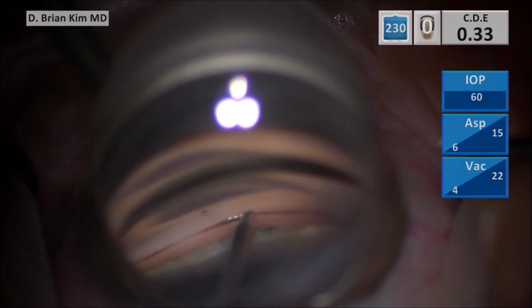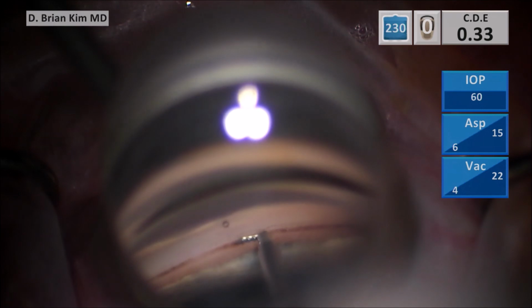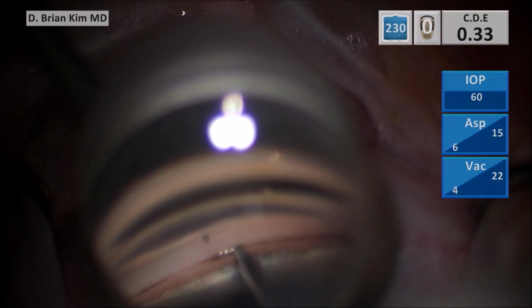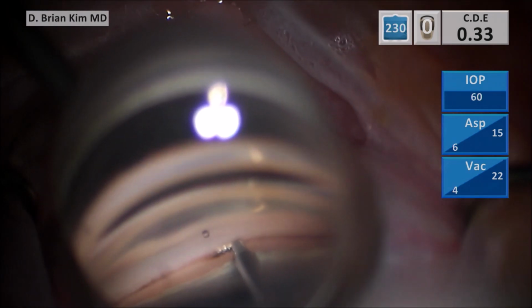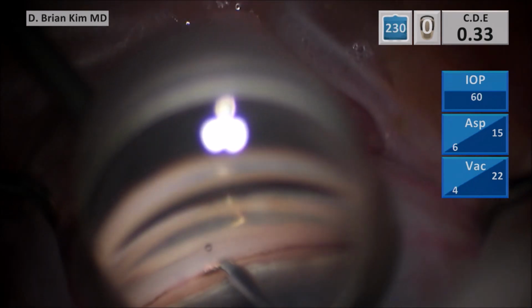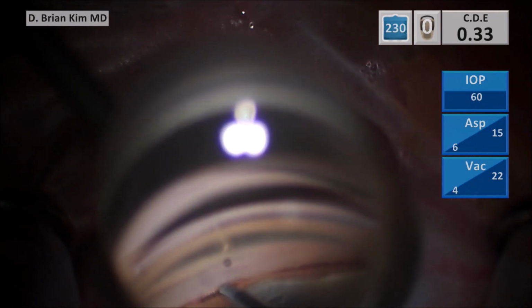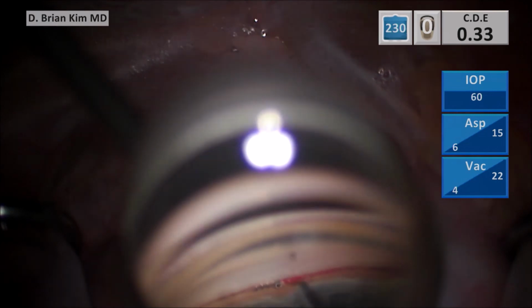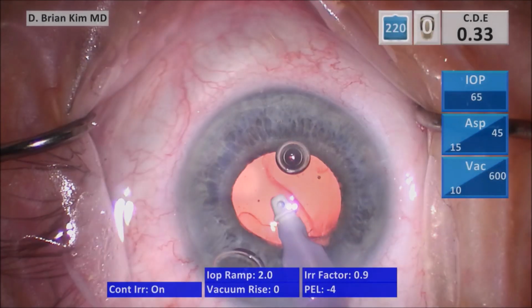And this technique is really kind of a stab first through the trabecular meshwork and then flatten out and make sure you're parallel to the trabecular meshwork. Once you've flattened out, you can advance and you can see you get a very nice positioning and sliding of the iStent. You can see a trail of blood, and that usually confirms that you're in the right position. I usually like to tap it and kind of strum the iStent to make sure it pops back into position. And usually this is a good indication your iStent is in good position.